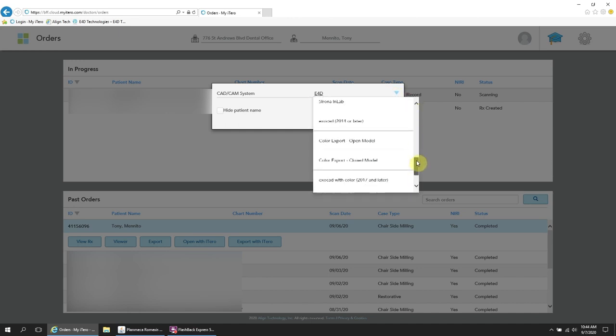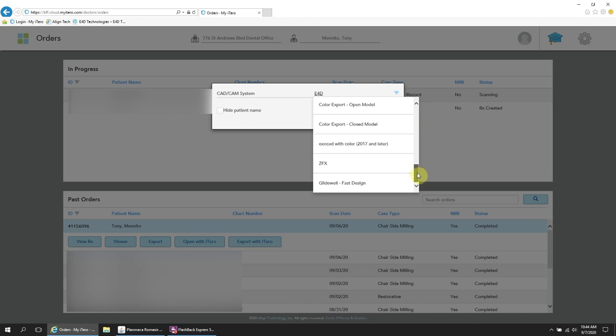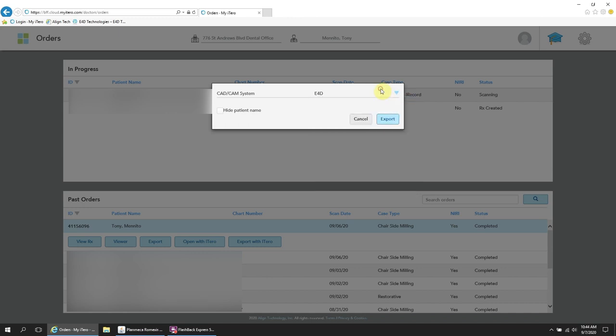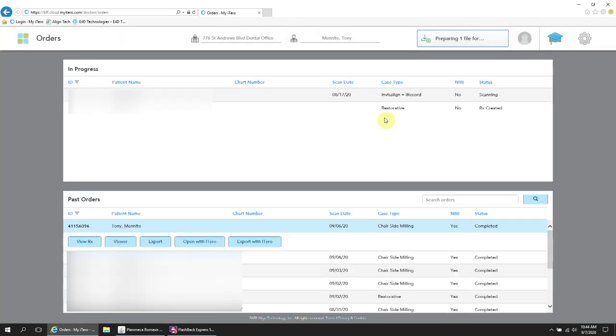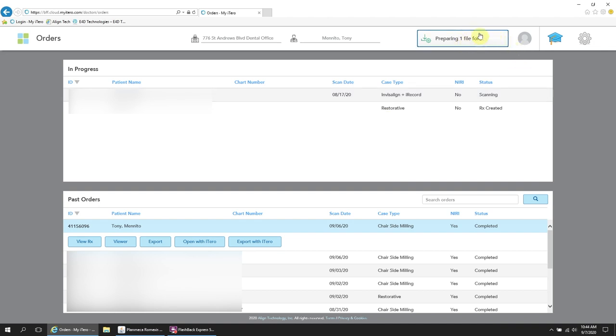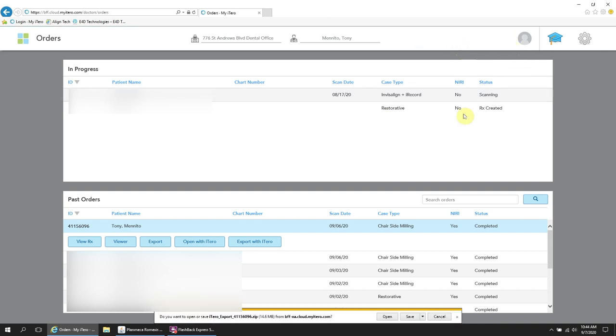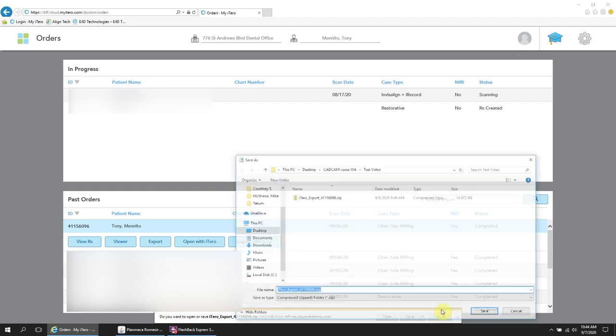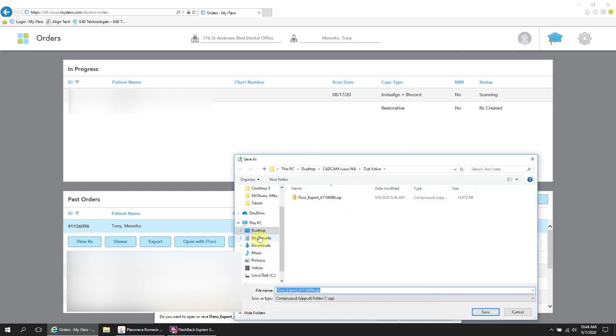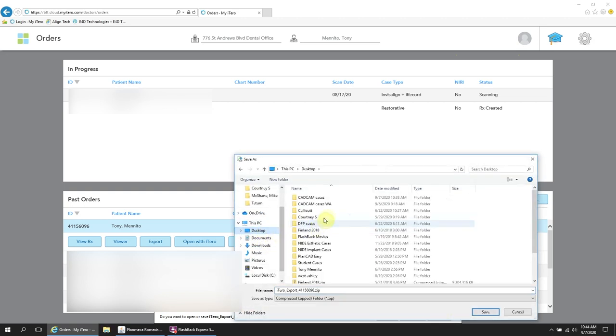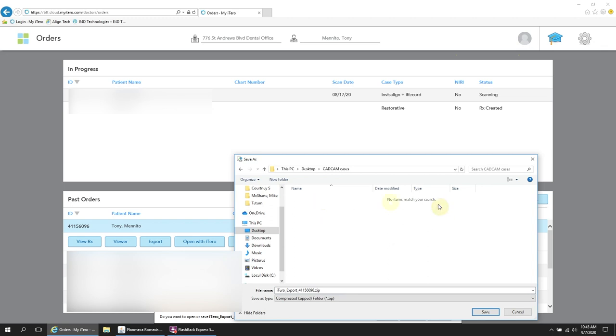So when iTero asks you what milling system you're using, E4D is the equivalent of Planmecca in this case. So that's the one you want to select. It will start the download process, but you want to make sure you click Save As because you want to specify where this file is going.